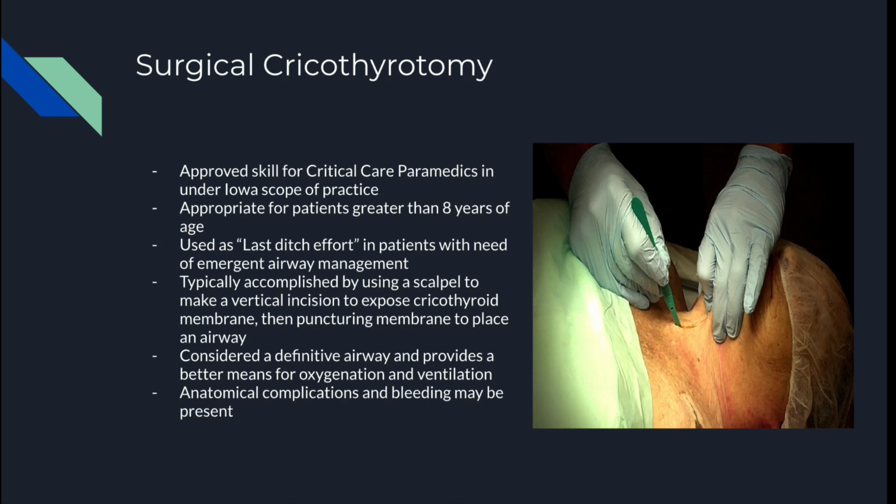So knowing how to do this and thinking about how you'd complete this procedure is very, very important. And knowing where those landmarks are and knowing the equipment that you have is very important to just think about in general on a day-to-day basis, or when you're doing your practice intubations.